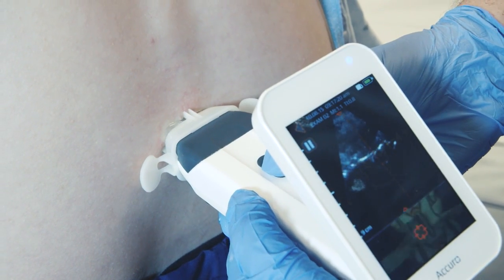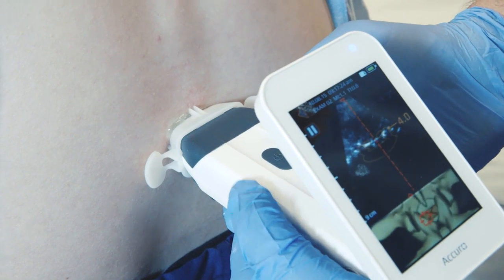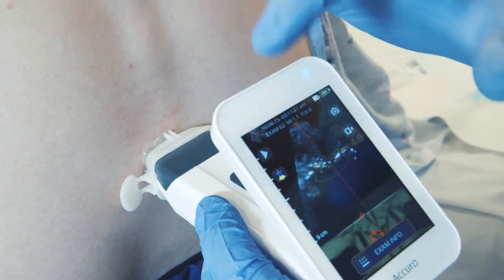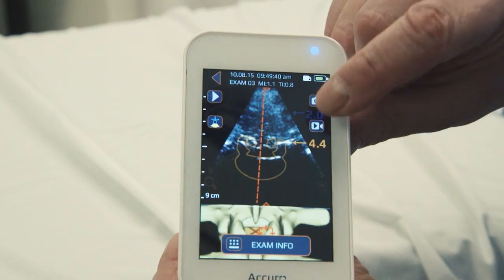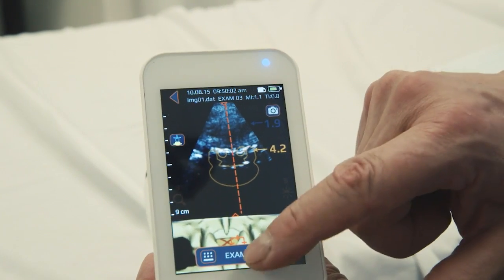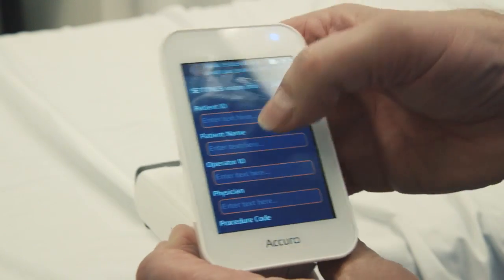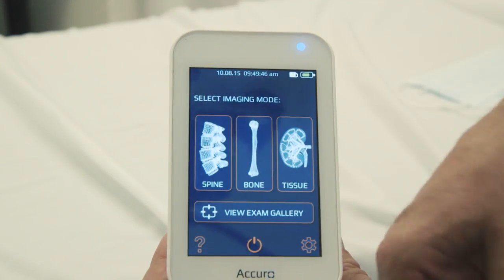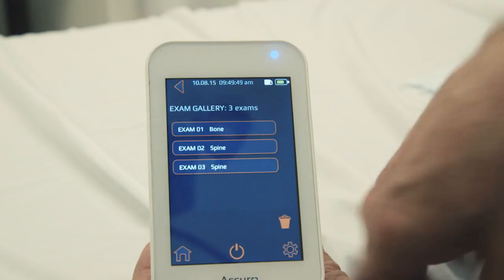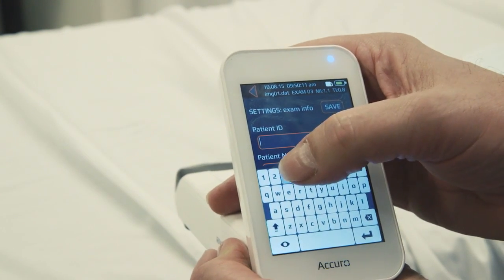Saving an image to an examination file can be easily achieved during live imaging by activating the physical button on the hand grip region of the Acuro. Alternatively, an image or video can be saved by pressing the pause button and then pressing the camera or video icon from the paused image screen. Patient information can be entered to associate it with the saved image, and after the exam the saved image can be found in the exam gallery where patient information can be further modified.